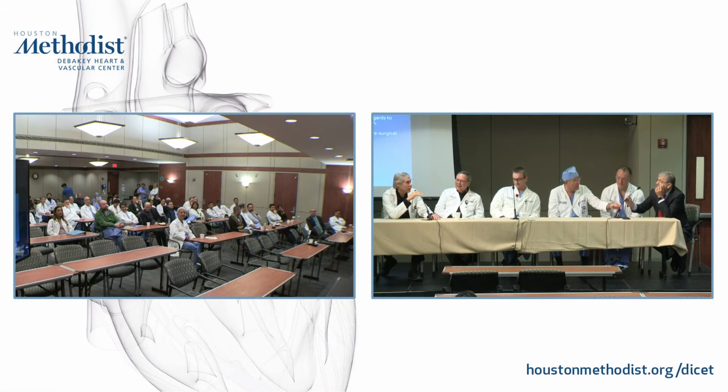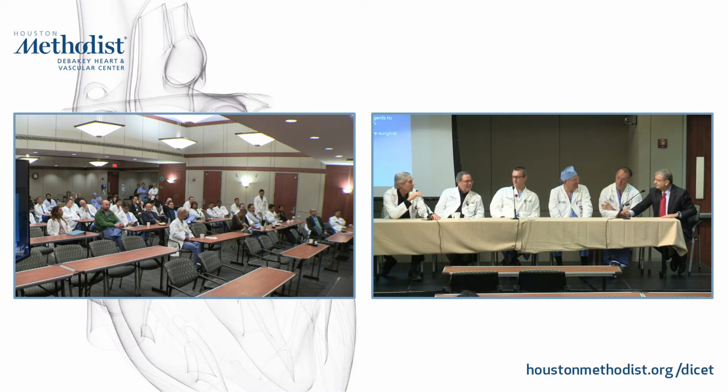Yeah, and one other thing I just want to mention is the A portion of the CTA, the angiography portion. These patients are sick enough, and this individual had a good GFR, good renal function, everything else. Of course, anytime you give contrast, that's an issue.